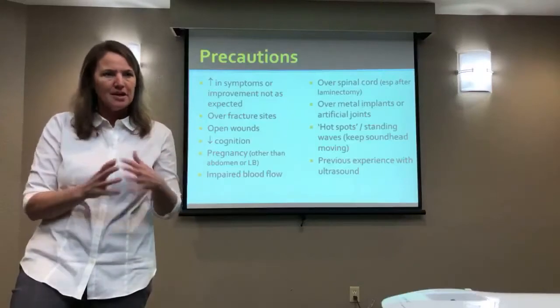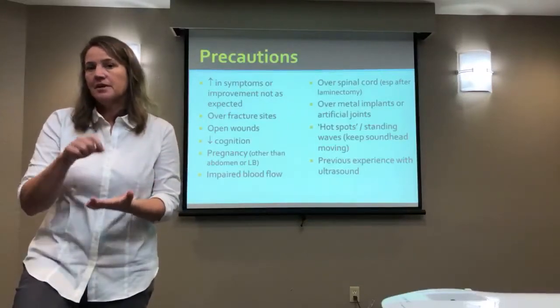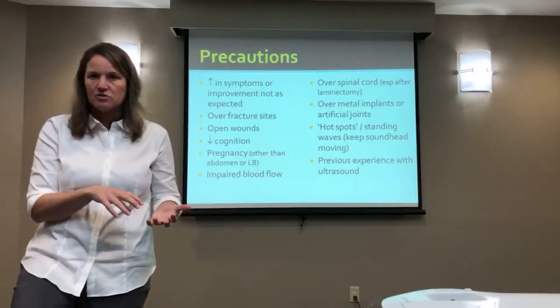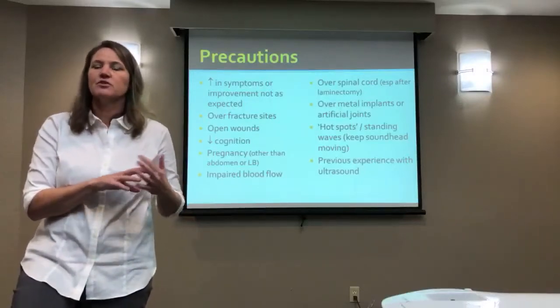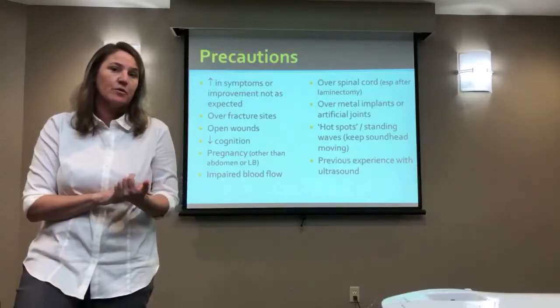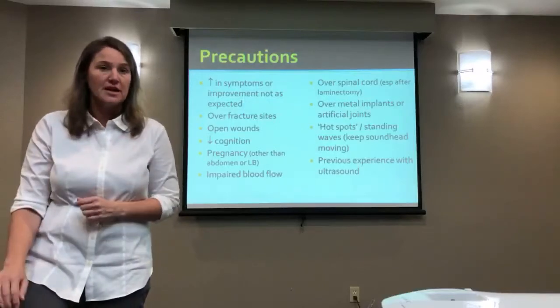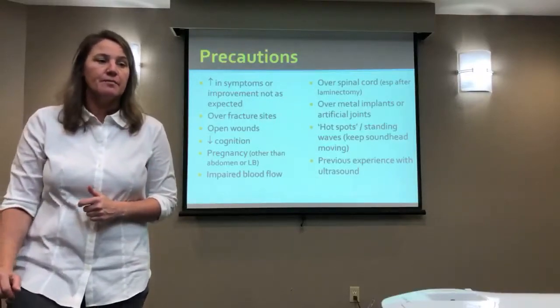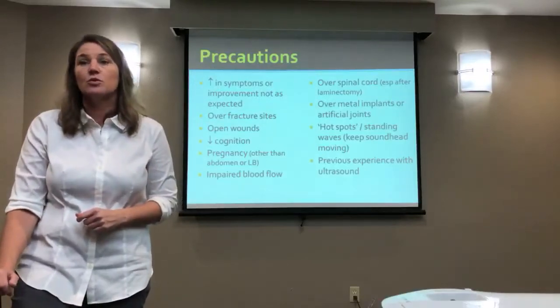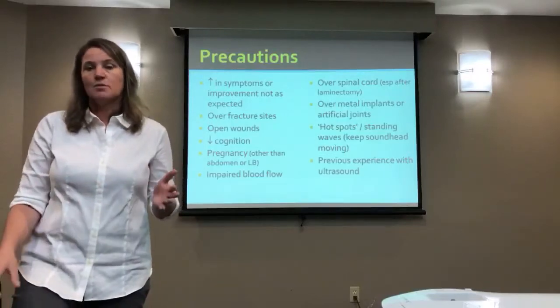So the more complicated the person becomes, the easier it is for me to document that this improvement is significant given the complicating factors of high tone, difficult positioning, poor compliance, whatever things I can justify it with would help justify the longer treatment, the more attempts at treatment. Versus someone who, let's say, has an open wound that's been present for months. I would give it longer.